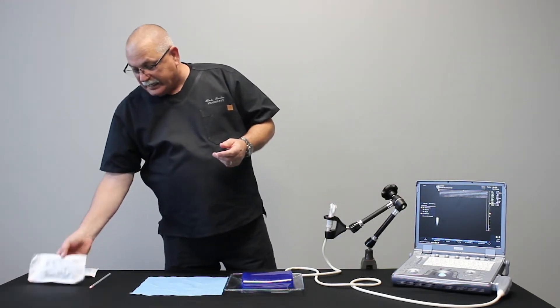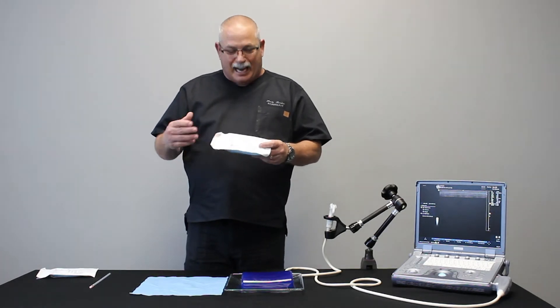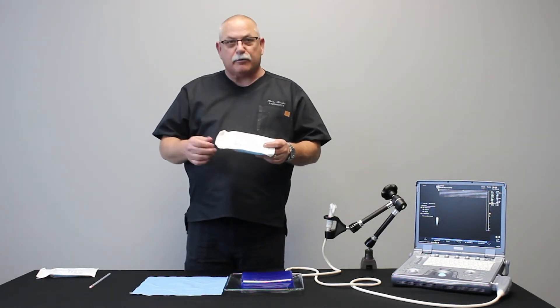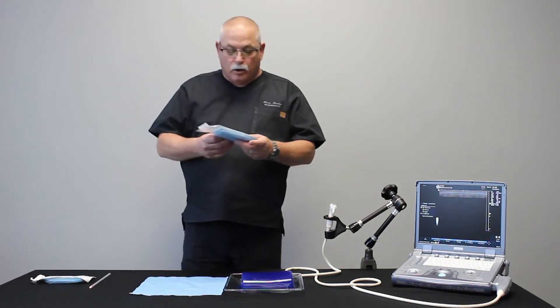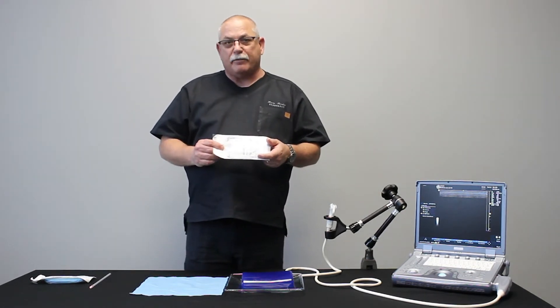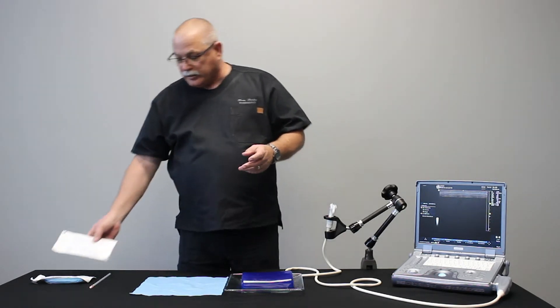Then we're also going to need a procedure kit. They come in two different types: we have a procedure kit for 12 to 18 gauge needles and a procedure kit for 18 to 25 gauge needles. Depending on what you're doing on any particular day will determine which one you're using.